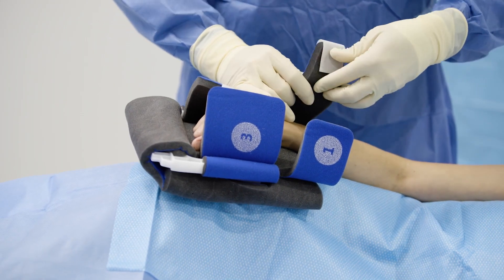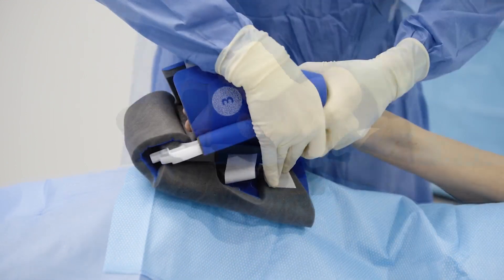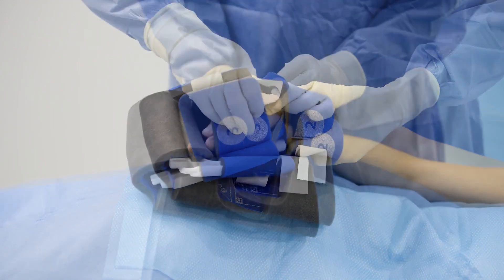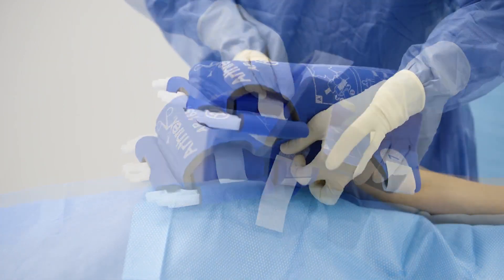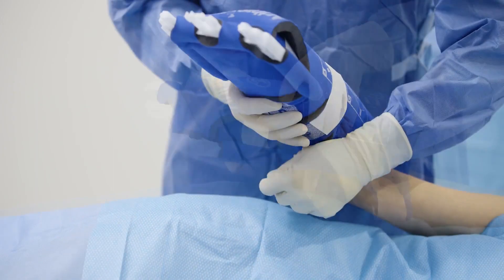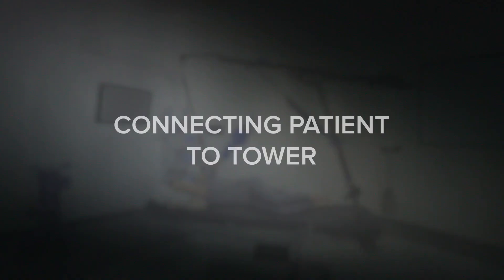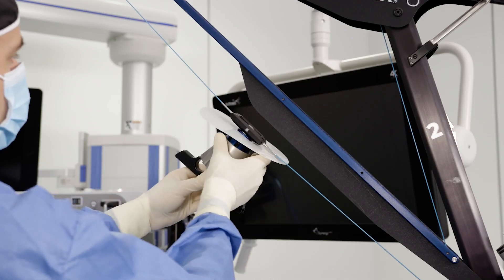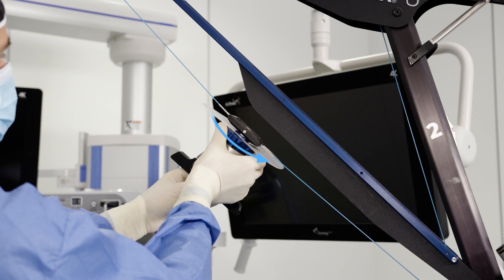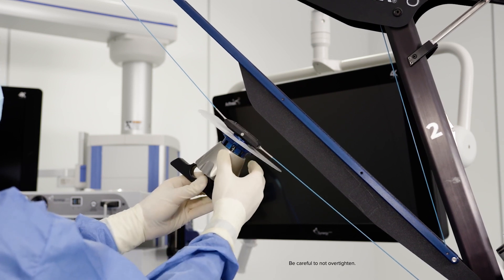Place the patient's forearm into the sterile arm sleeve with their hand in a gentle fist, and wrap the Velcro tabs around snugly in sequence, resulting in a secure attachment for arm suspension. Hook the autoclavable arm sleeve connector with a circular sterile disc barrier onto the cable trolley and advance the blue coupling screw in a clockwise direction to secure the connector to the cable trolley.